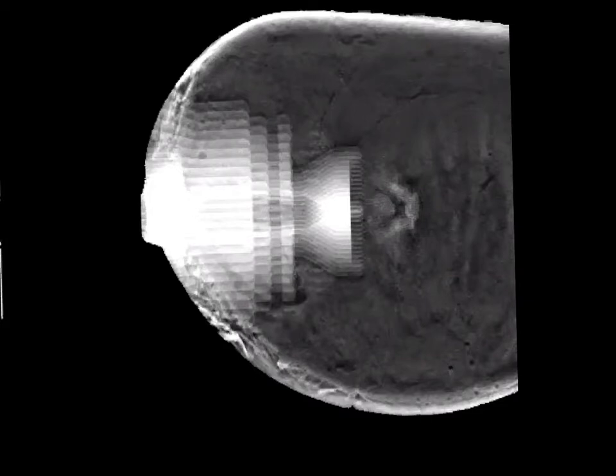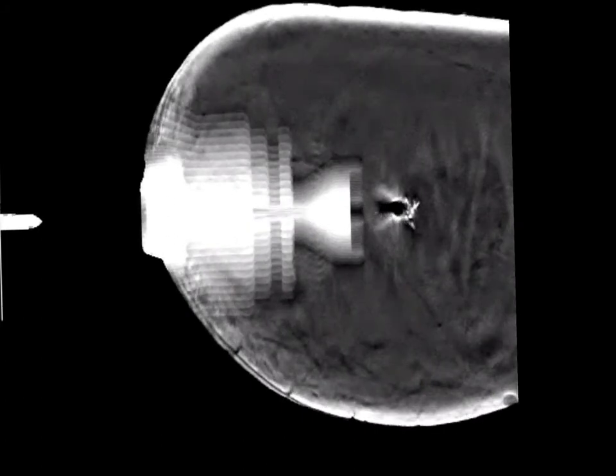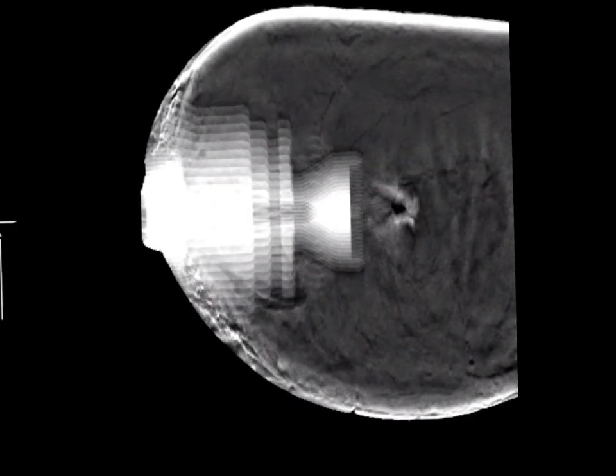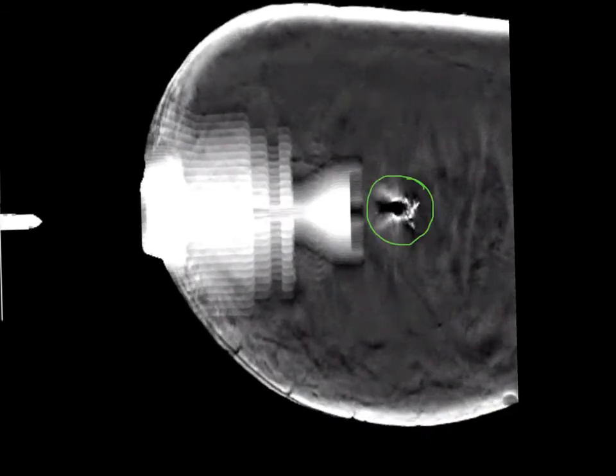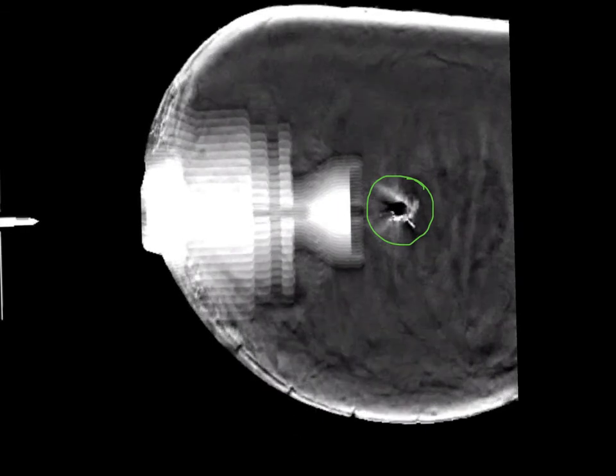In patients who have non-calcified lesions, we will do a second tomosynthesis image to look at the site of the biopsy cavity and we're going to be comparing the site of that cavity, in particular the level, with the original images which were taken before the biopsy.